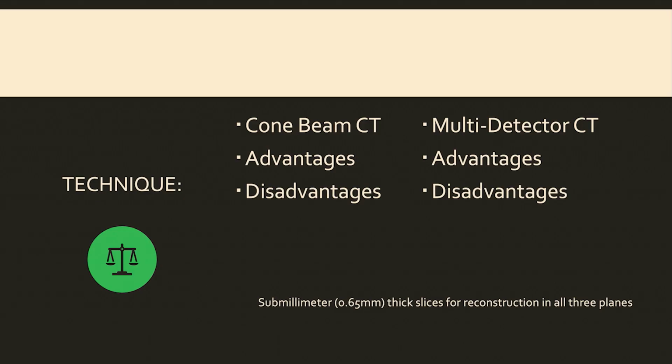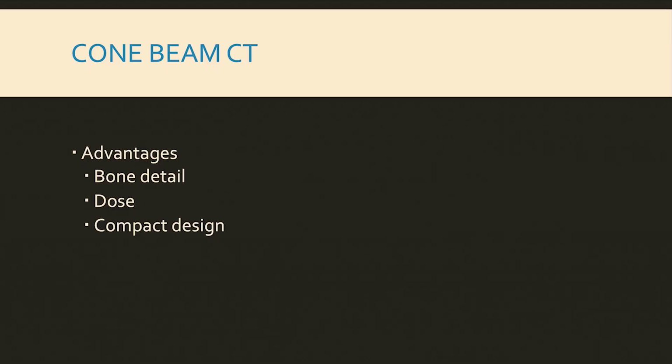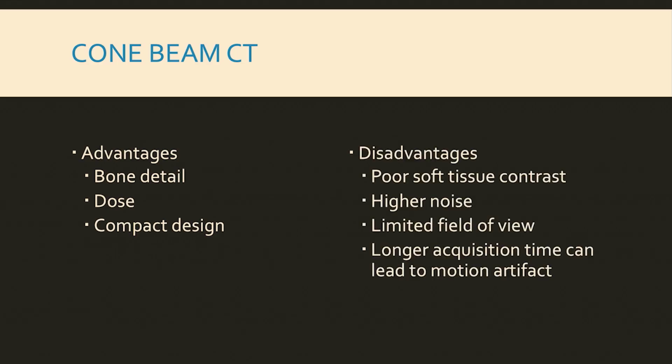So we see a lot of cone beam CT, especially with our dental patients. So cone beam, just to run through, because none of you are really looking at this stuff anyway, but it's got exquisite bone detail. The dose is much lower and very compact size, so people have them in their offices. Like I said, dentists, oral surgeons, facial OMFS.